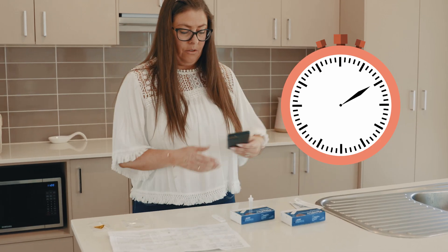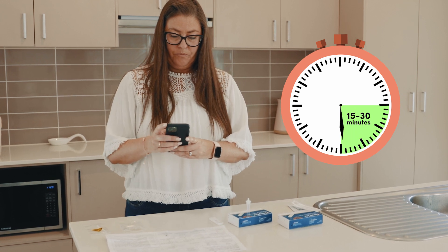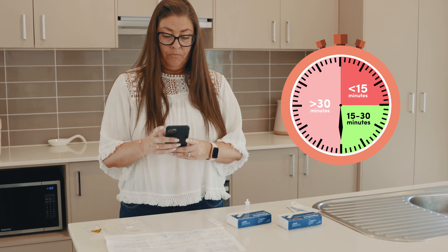Check the time and set a timer to ensure you read the result between 15 to 30 minutes. Do not read the result before 15 or after 30 minutes.